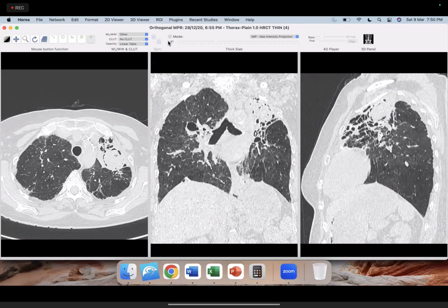The typical fibrosing ILDs like UIP, where we also discussed CTD, then NSIP. Cryptogenic organizing pneumonia I didn't show because it's very simple, with bronchocentric and atoll sign, etc. And then we also looked at the nodular ILD, HP, sarcoid, and finally some cystic lung disease. I think there are a bunch of questions already in Q&A, so I'll take those first.